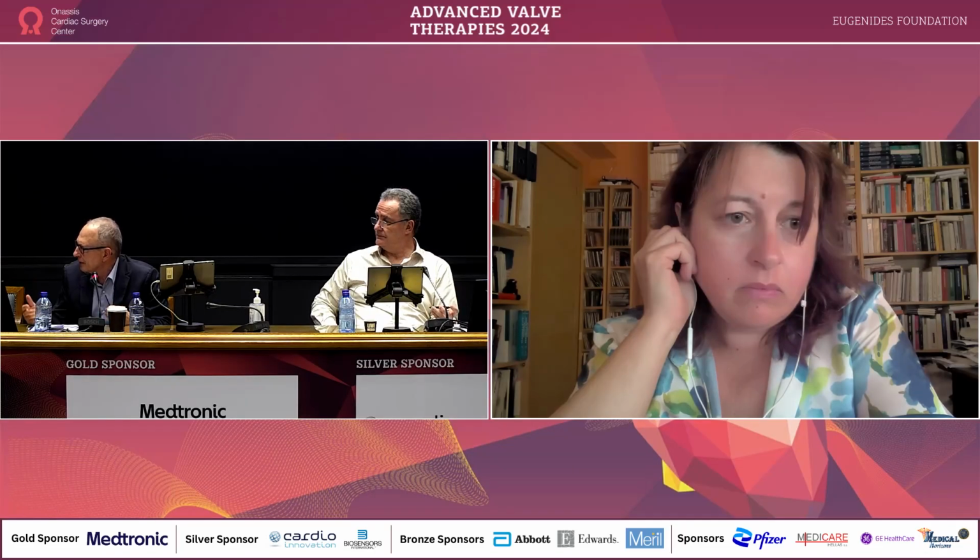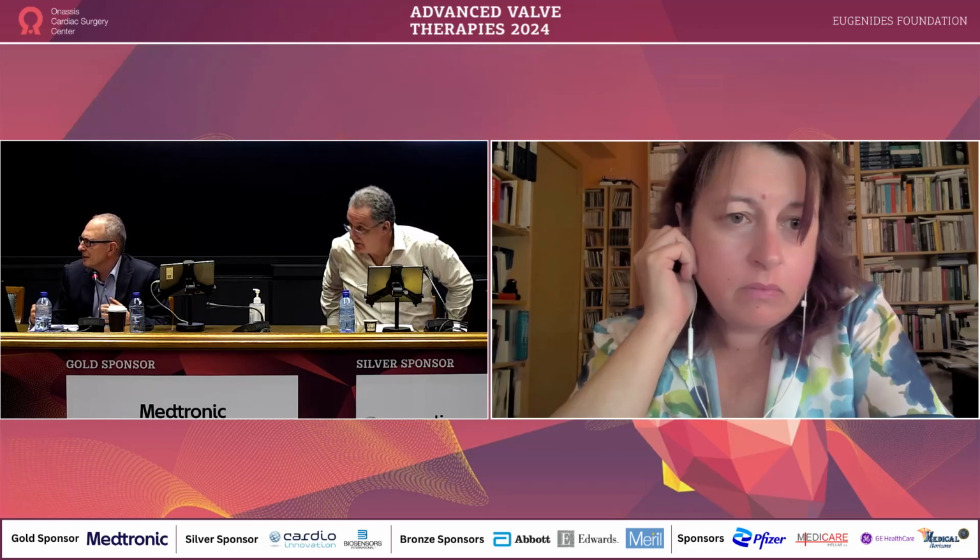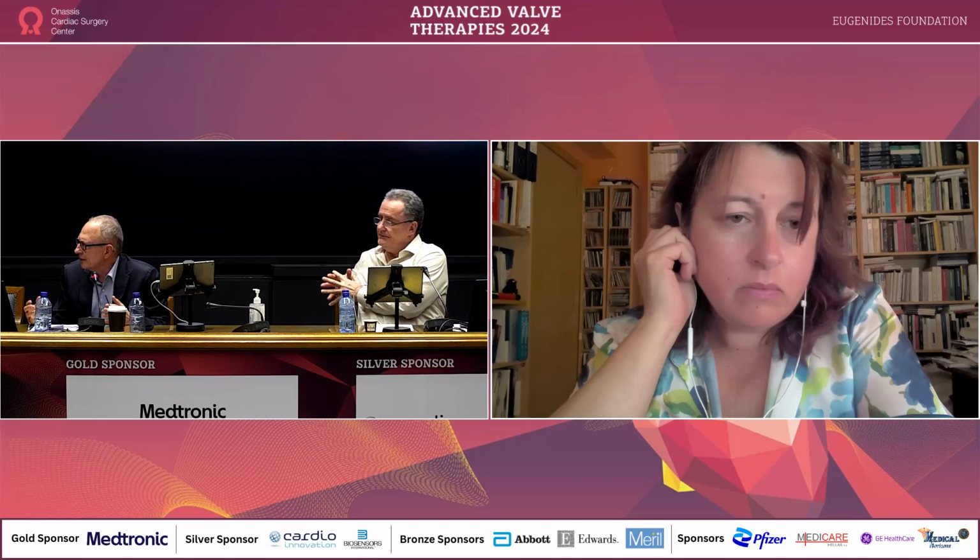And my question is, a lot of the times, all the angulations that you as CT analysts provide do not reflect what I am seeing in the cath lab. Is it the position of the patient? Is it because sometimes it's hard to see exactly where the leak is? Why is this discrepancy?